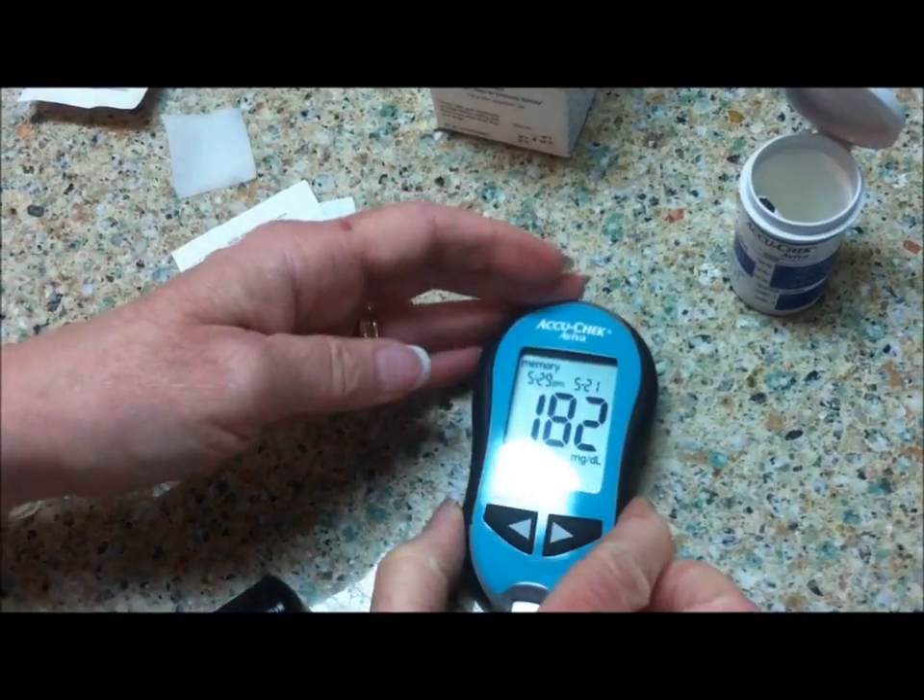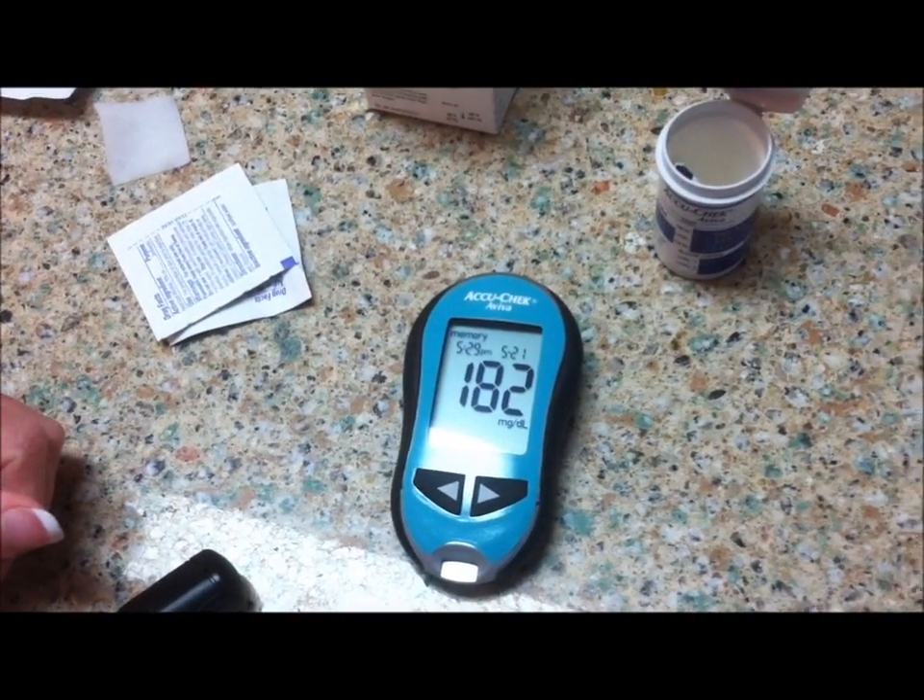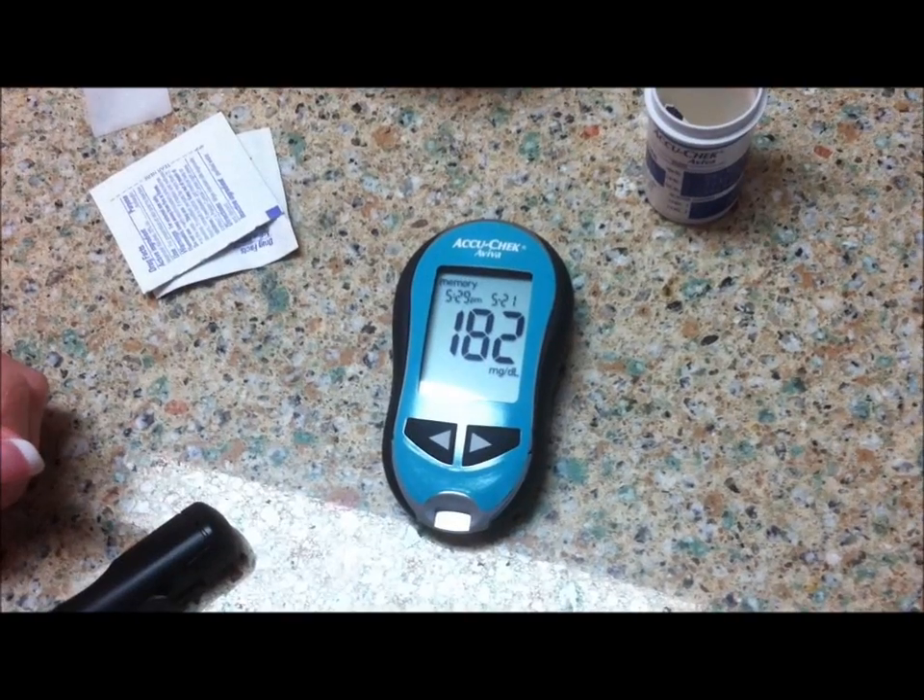And that's the use of the AccuCheck Aviva blood glucose meter. Thanks very much for listening.